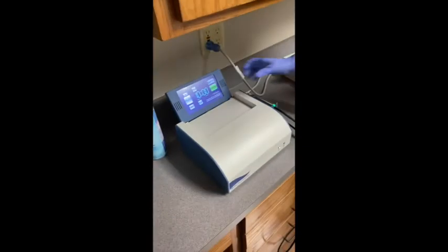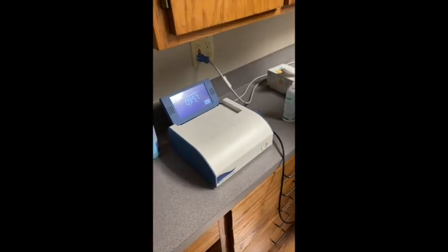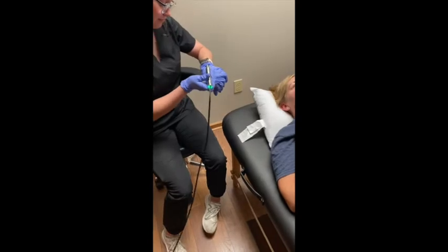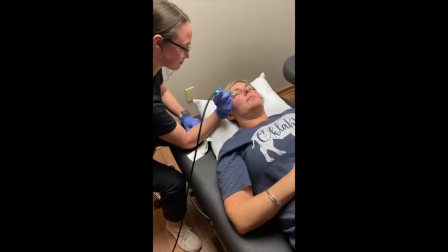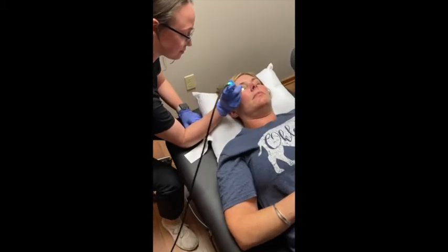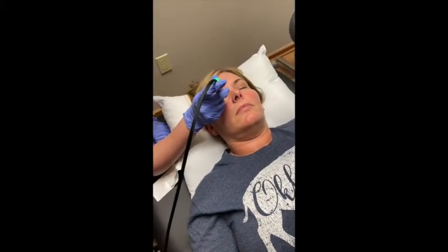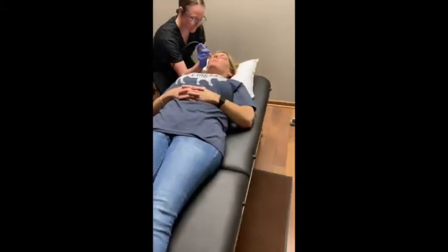But basically, this is the Miboflow, and this is kind of how it works. It takes about 10 minutes for each eye. Claire's got a little bit of ultrasonic gel there on her glove. And that little device, the instrument there, gets pretty daggone hot. And we just rock and roll it on the eyelid there, as you can kind of see. And so I'm going to come around to the other side. I think I'll get a better view.